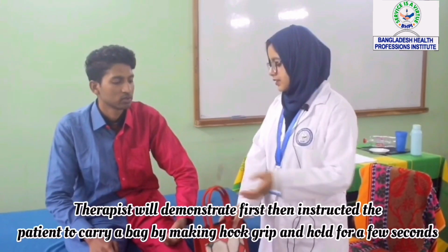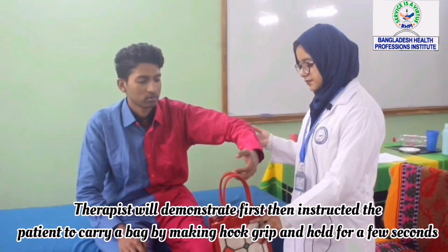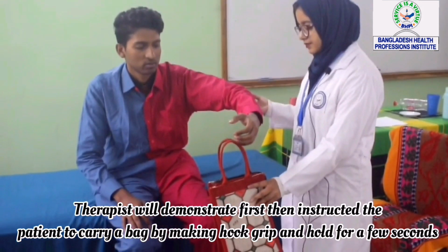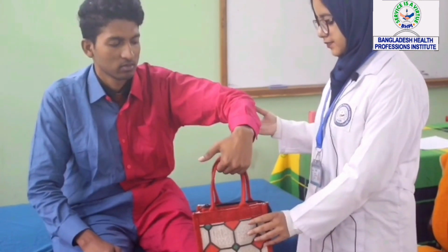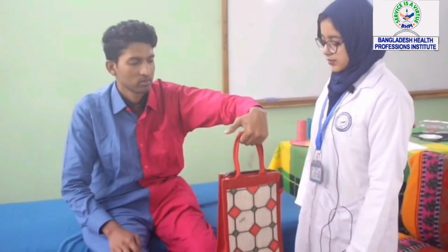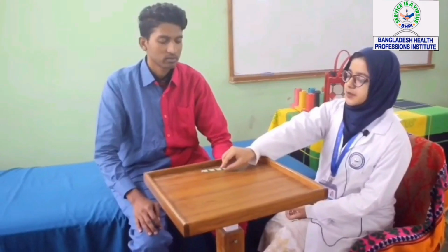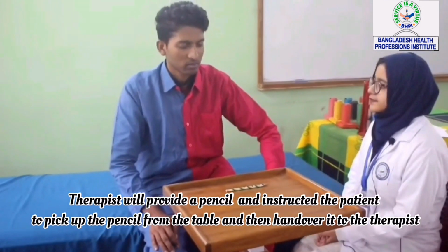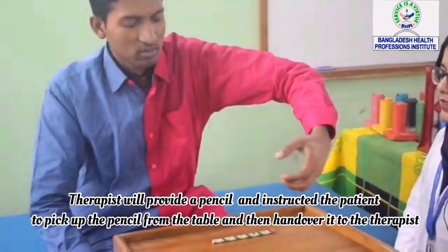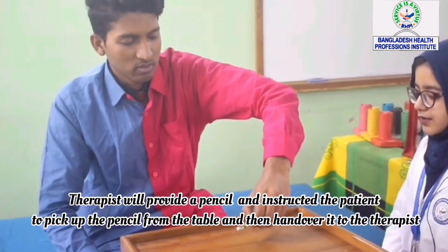The therapist will demonstrate first, then instruct the patient to carry a bag by making a hook grip and hold for a few seconds. The therapist will provide a pencil and instruct the patient to pick up the pencil from the table and then hand it over to the therapist.